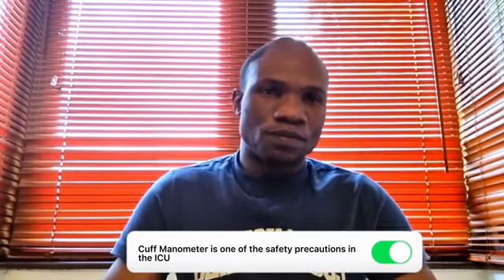So let me come to the instrument proper now, the cuff manometer. I will talk about different parts of the cuff manometer. The first part is the handle. We call it a rubber bulb handle. It looks like a bulb, and it's made up of rubber, so that's why it is called that. It is the part that you use in handling it.